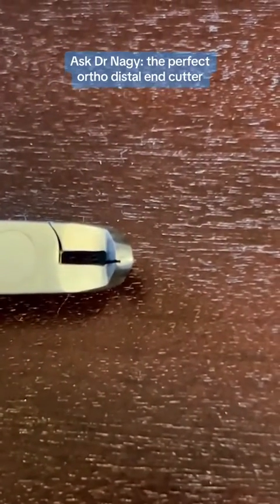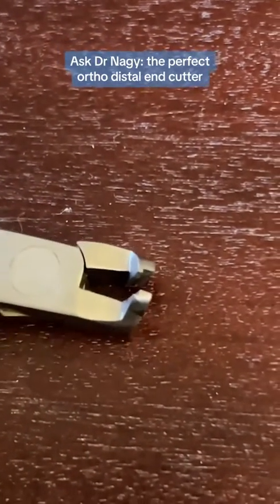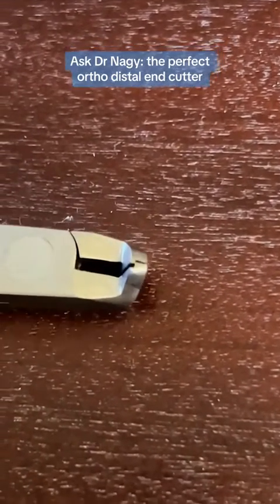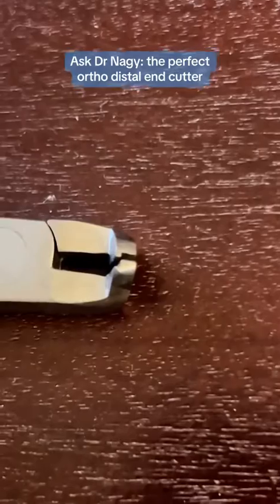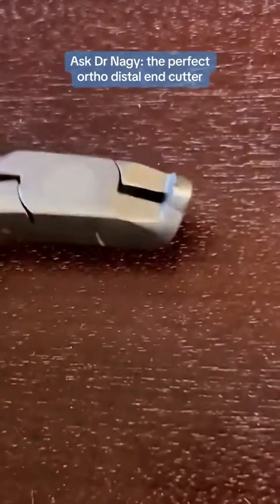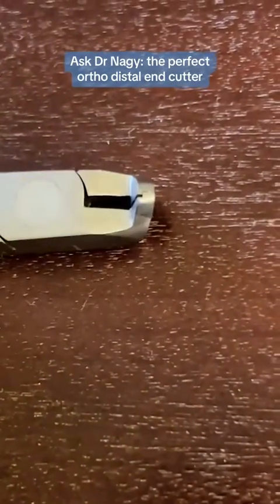But this one doesn't cut flush. It will hold the wire — so that's one of the requirements met — but it doesn't cut flush. You're going to end up with just a little bit of a distal end that the patient may complain about. So this is nice and compact and it holds the wire, but it's not cutting flush. Let's move on.